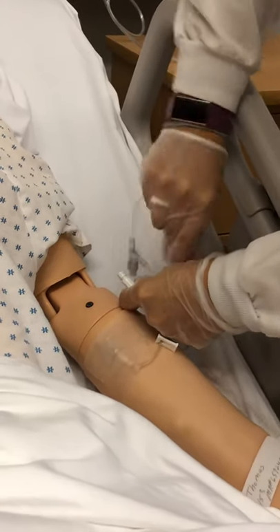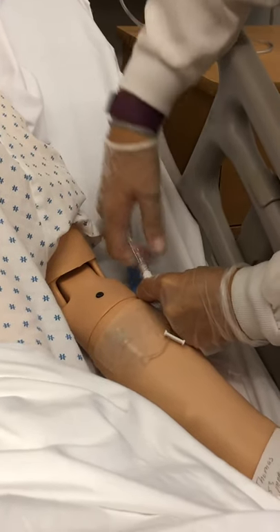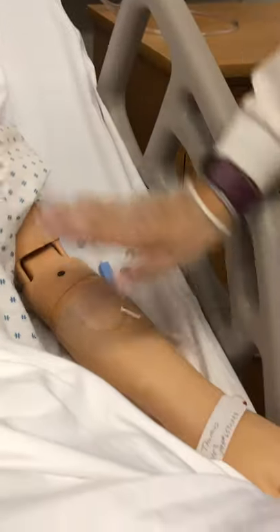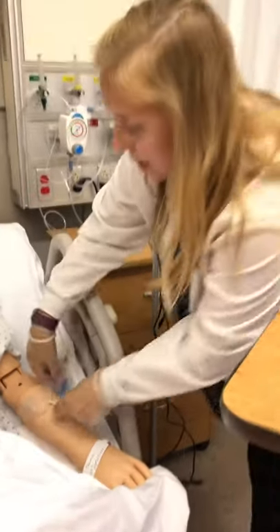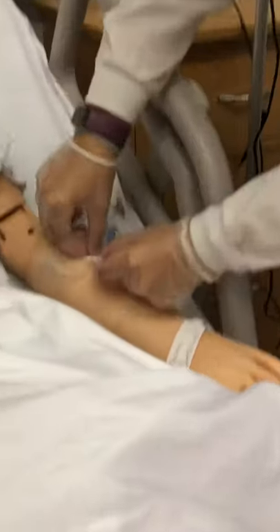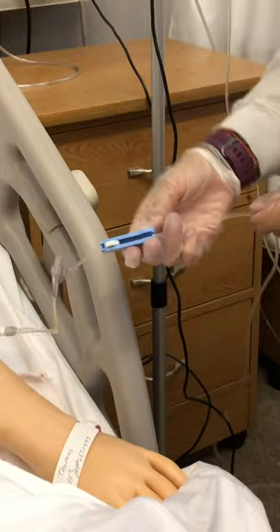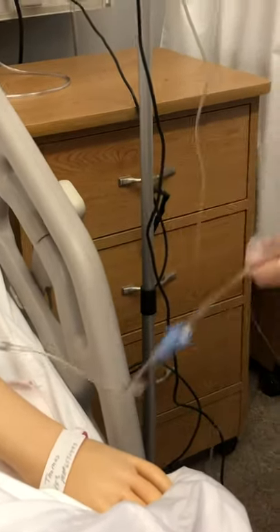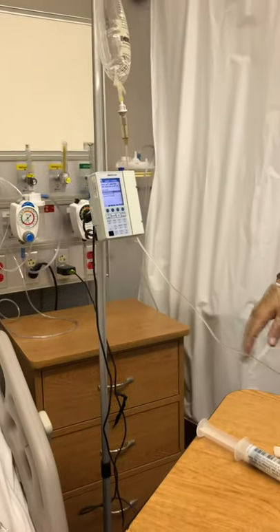I'm going to take the cap off my IV tubing and push and twist to attach it. Then I like to start from the IV and work up to the back to make sure all my clamps are open. There's a clamp on this IV tubing — make sure that's open. I'll undo my clamp here and go all the way up to the pump, and everything looks good.